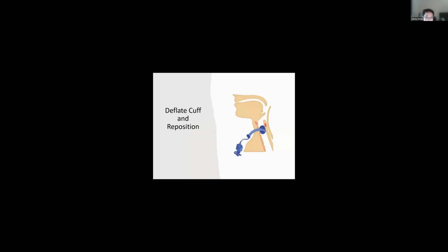All right. If they are not improving, essentially at this point, the trach is not functional, right? So it's a scary thought, but if it's not functional, it's just in the way now, because it's just some tube that's in your larynx, but you're not able to ventilate through it. So you want to remove it completely.